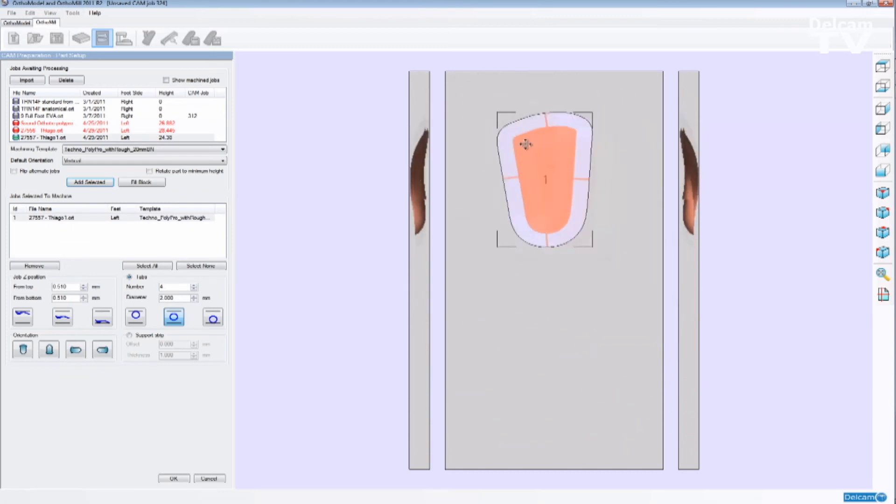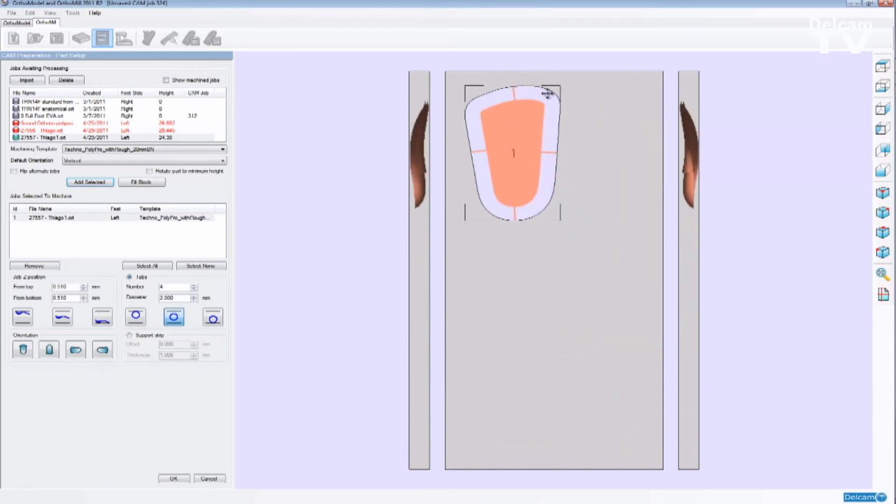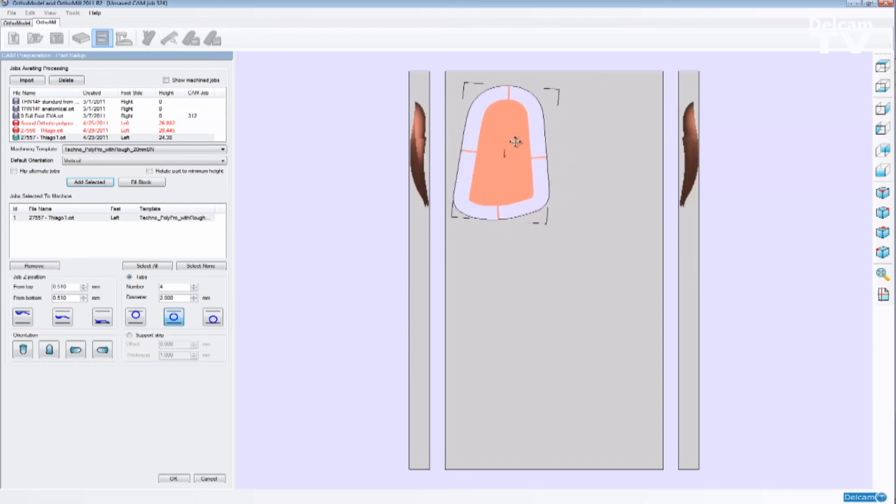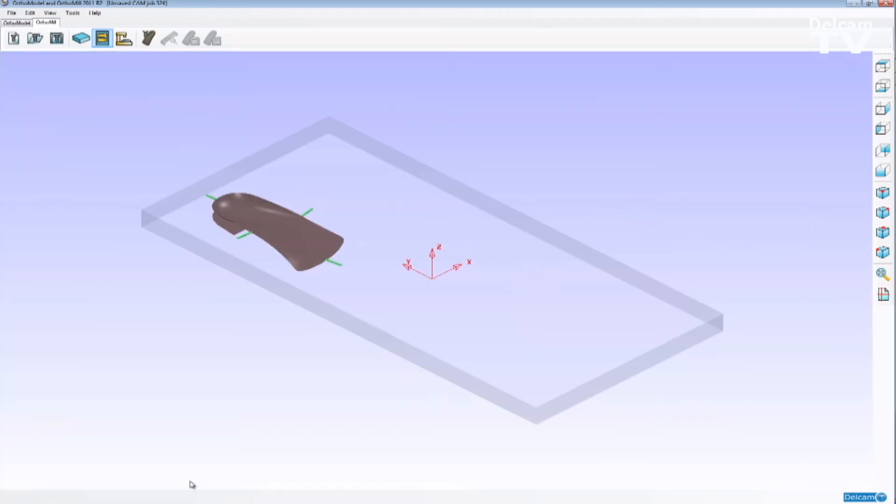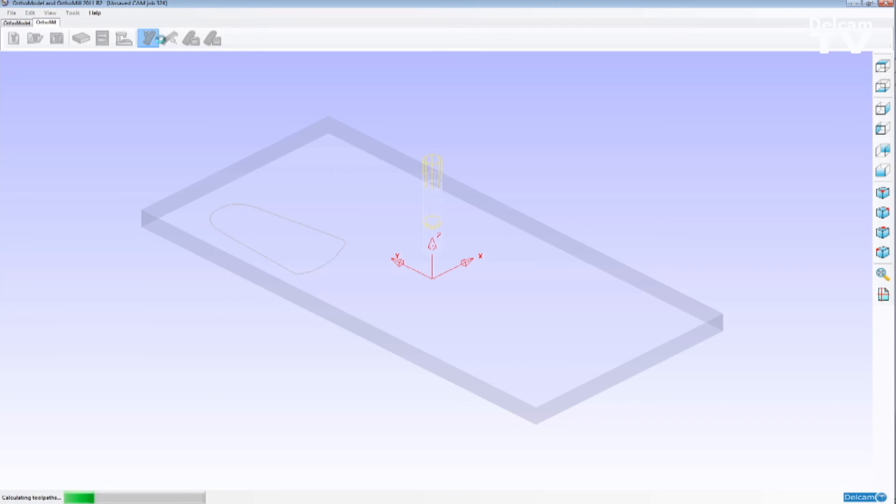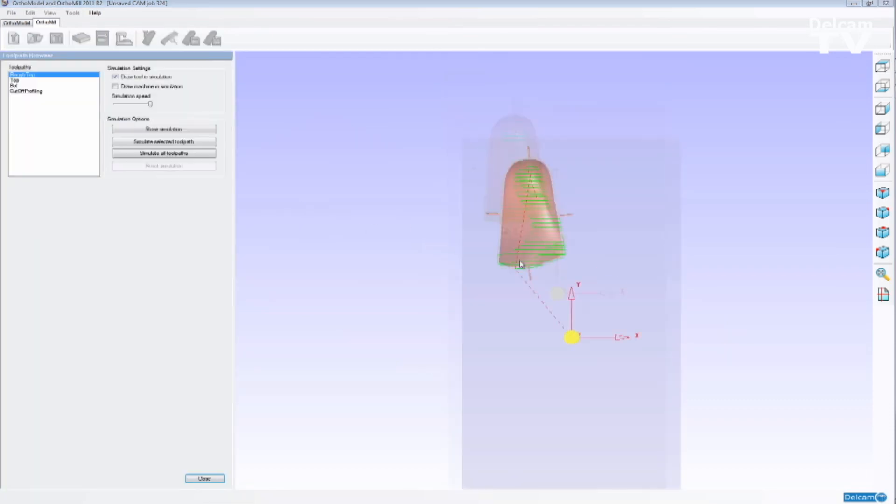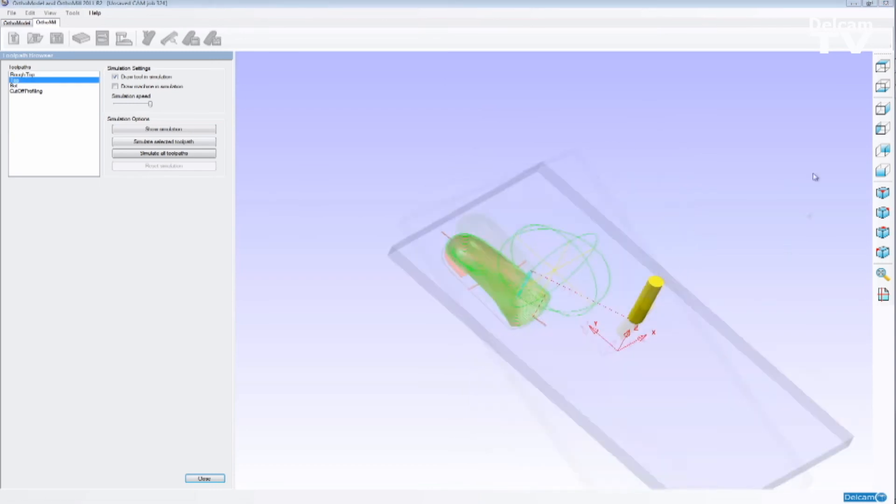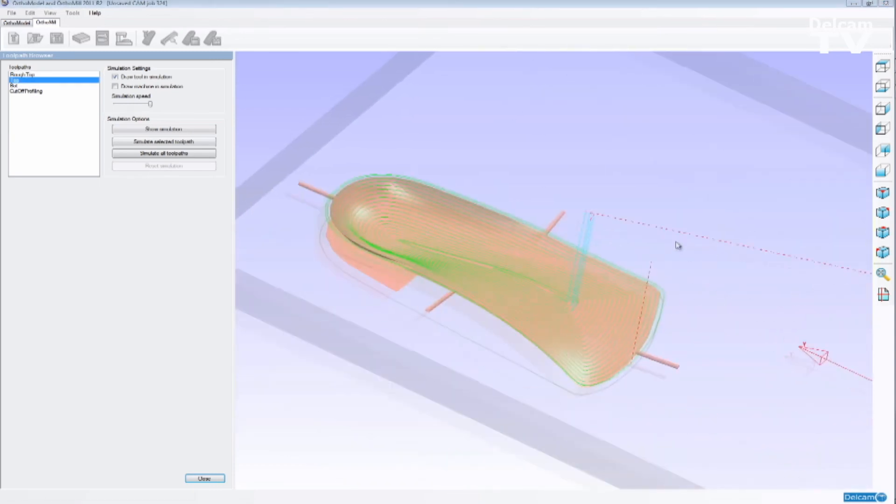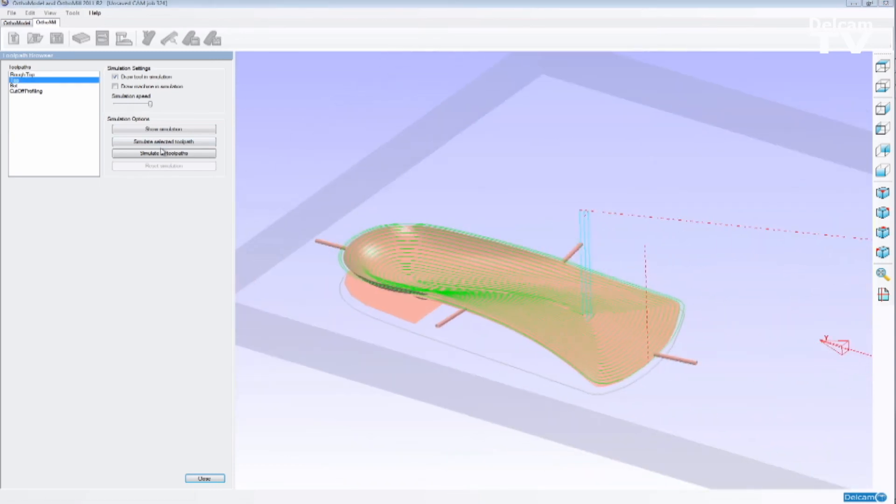And I can position this orthotic anywhere on the screen or rotate this orthotic accordingly. And the software now is going to prepare the block and calculate the toolpath for us. So OrthoMule is going to select a tool. It's going to design the toolpath for the top, flip the block 180 degrees, create the toolpath for the bottom, pick up a different tool and do the cutout for us all automatically.